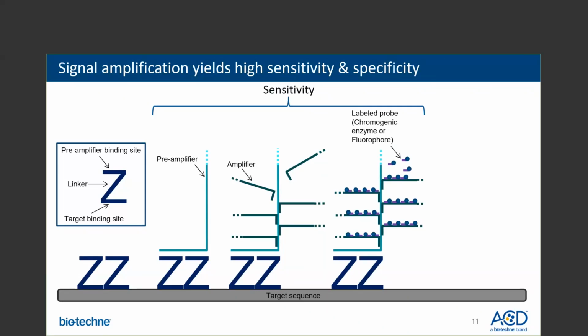signal after chromogenic reaction, detectable under a standard bright field microscope. The labeled probes can also contain fluorophores that allow for visualization of signal under a fluorescent microscope. This signal amplification strategy allows for visualization of target RNAs as single dots, where each dot represents an individual RNA molecule.